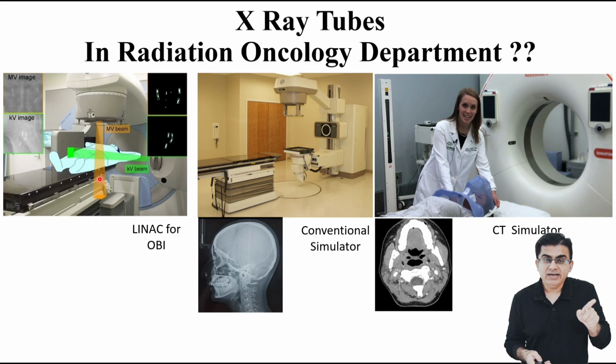But now look very, very carefully. Look exactly 90 degrees away from that main beam. Look at that separate arm hanging off the side, that C-arm. Inside that arm sits a standard diagnostic X-ray tube. It is exactly like the ones used in the radiology department. And it is firing that green beam you see on your screen. This is your onboard imager, in short OBI.